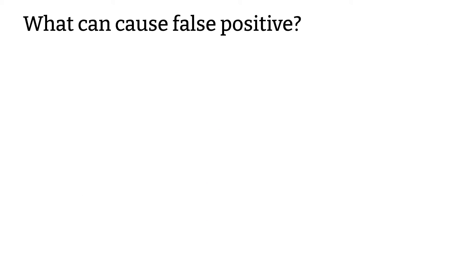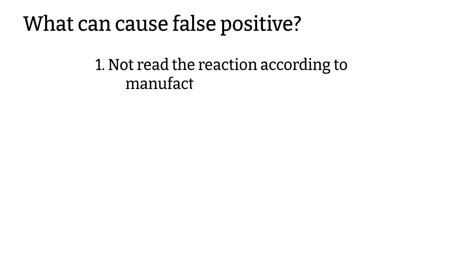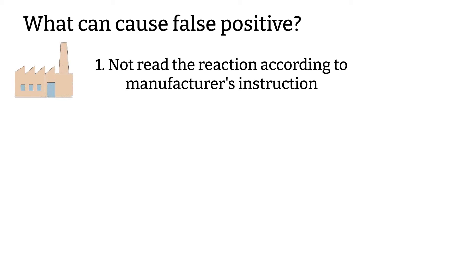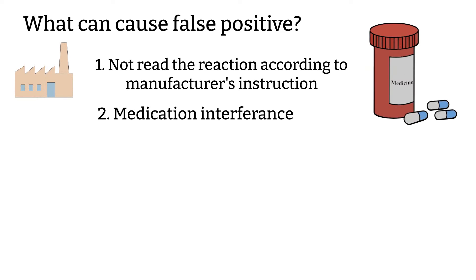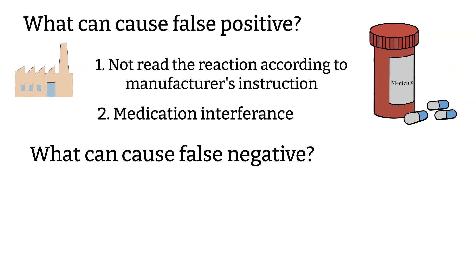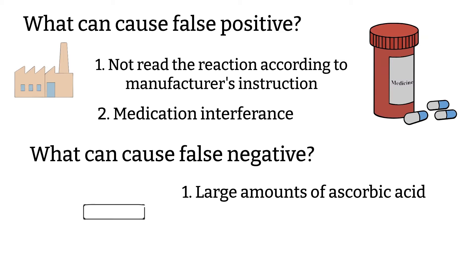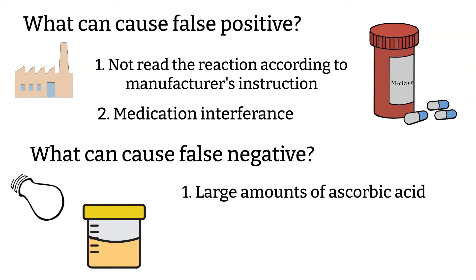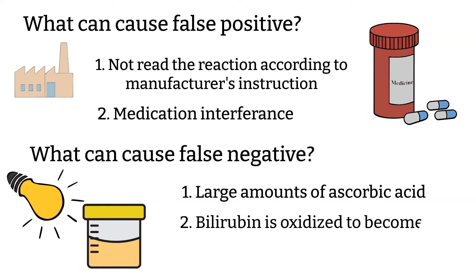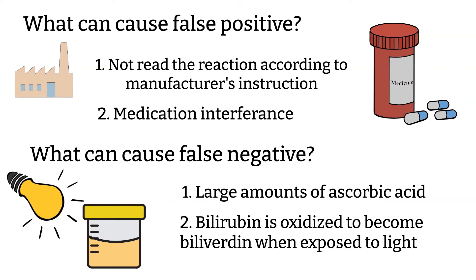What can give false positive test results? First, if the reaction is read after the manufacturer's indicated time. Second, some medications can interfere with this test. And what can give false negative test results? First, a large amount of ascorbic acid. Second, if the urine has been left for too long before the test is performed, the bilirubin will oxidize as the specimen is exposed to light at room temperature.